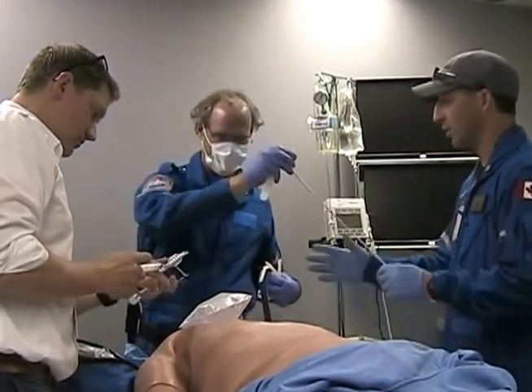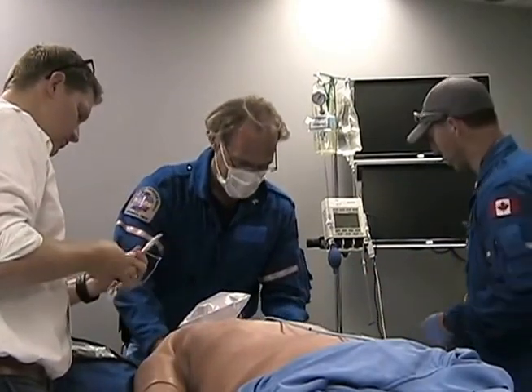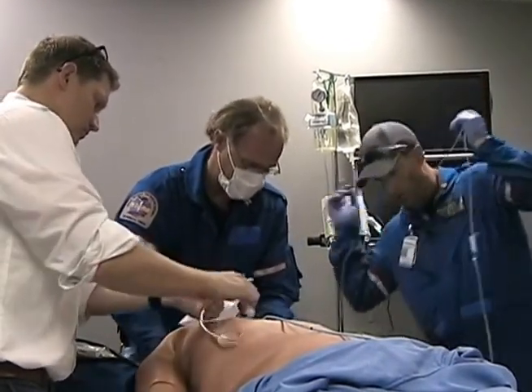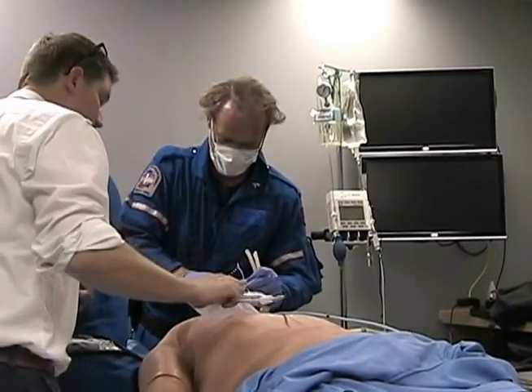What can I do to help you? Bruce, can you get the BVM and put the PEEP on that? Sure. And just make sure that that's all ready to go. Yeah, sounds good. Awesome, I appreciate that. Okay, he'll accept an OPA. Yeah, he does.